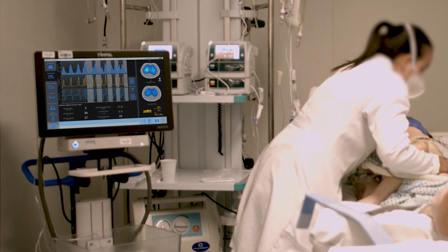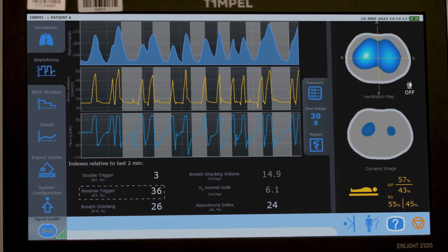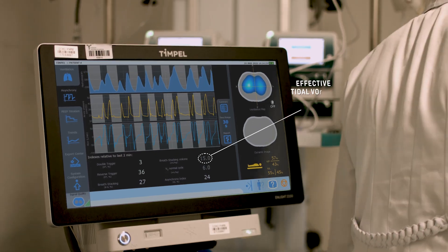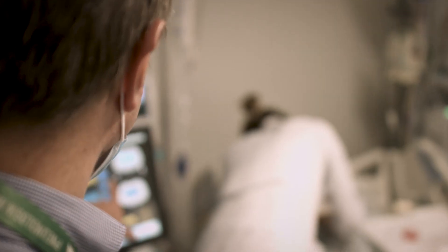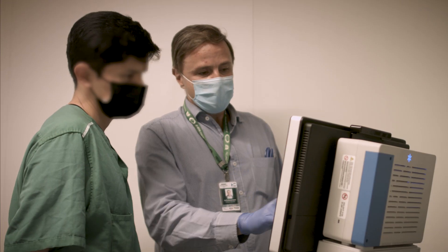Counterintuitively, when the physician started to decrease the tidal volume to 6 mL per kilogram — and the physician didn't realize this — the patient started to present many cycles with reverse triggering, and this reverse triggering was causing many cycles with breath stacking, with an effective tidal volume of 15 mL per kilogram. The intervention didn't work as planned, and we could determine the reason and solve it.